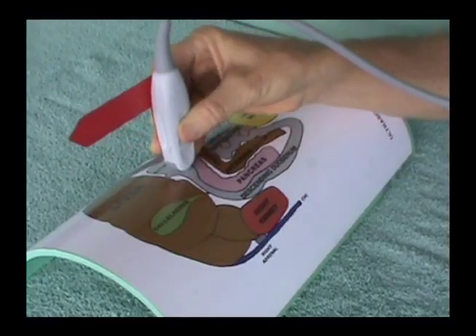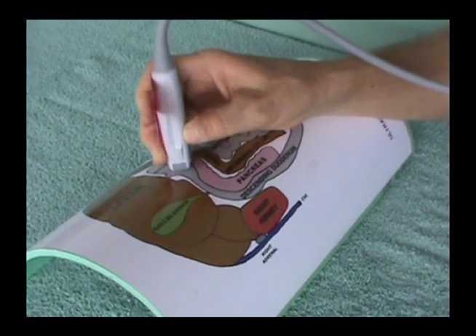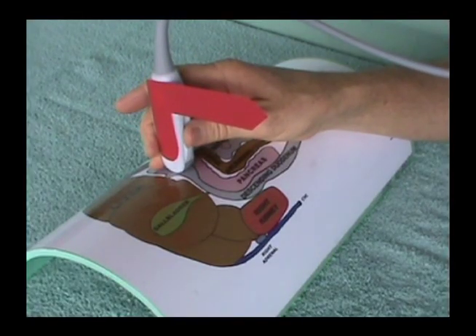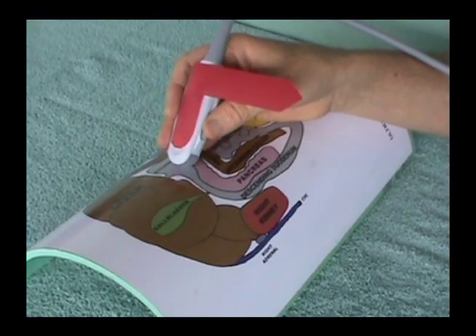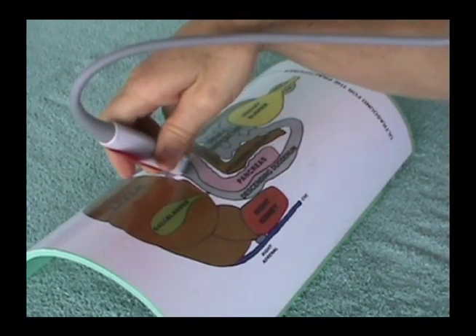Return the transducer to a perpendicular sagittal position over the stomach and rotate to a transverse position. From the transverse position, you can fan cranially toward the liver or fan caudally.